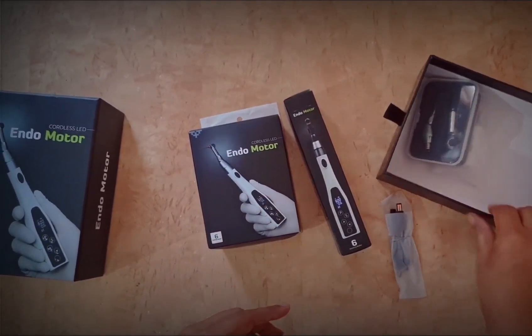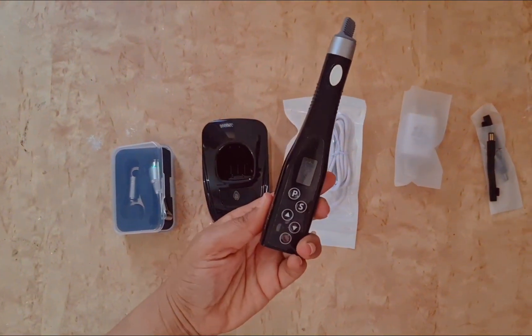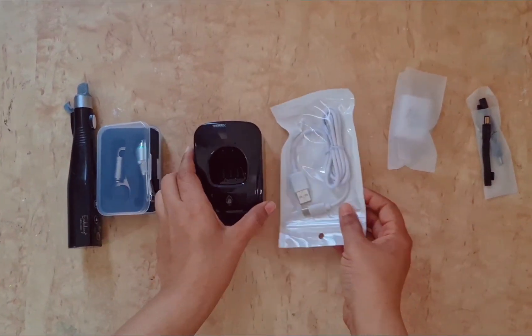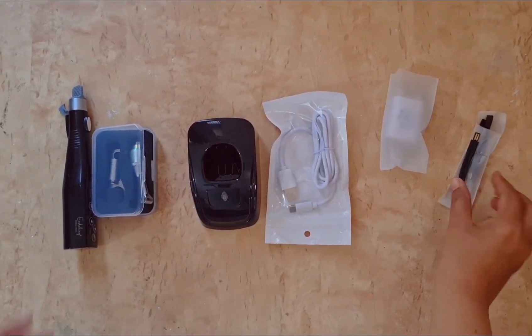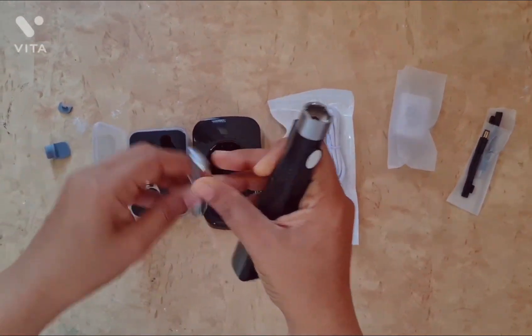I received it in three to four days after placing the order. It looks nice, and this endomotor comes with the endomotor unit, a charging unit, a power adapter, an LED light, an instruction manual — useful if you are using it for the first time — and the endomotor contra head.